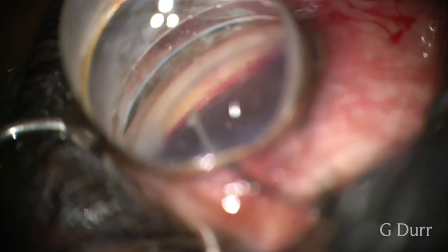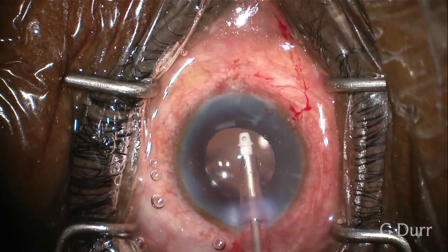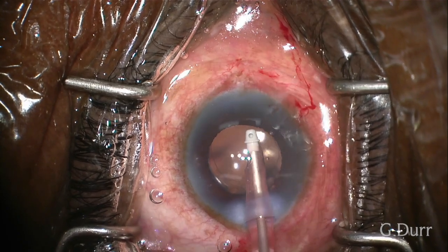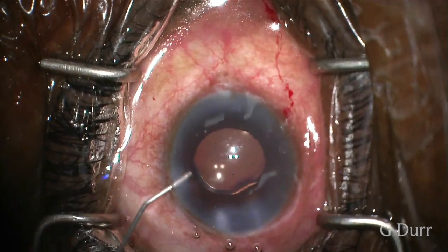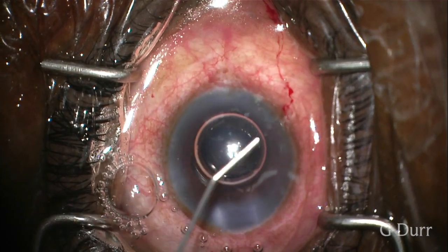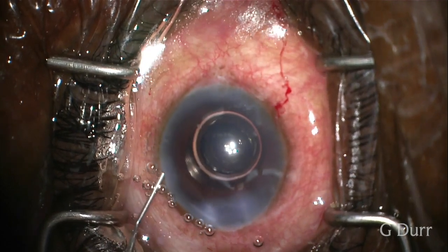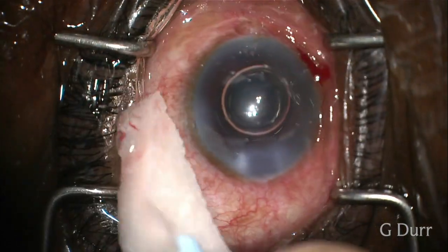And we're hoping that this will help decrease the pressure in this patient that had a significant IOP spike due to the pigment dispersion. We're going to put some air in the anterior chamber, leave a little bit of viscoelastic to avoid some heme reflux, hydrate our incisions, and ensure that there are no leaks.